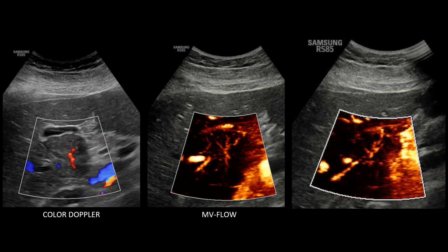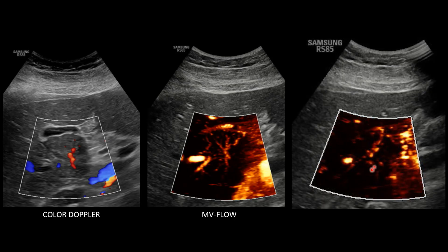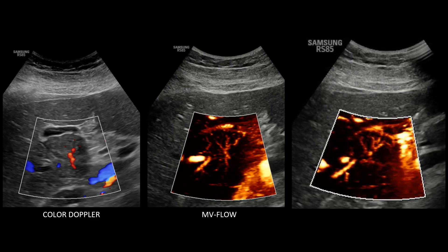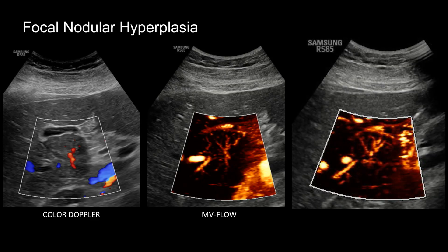When we look at that on real-time imaging, we can see the vascularity pulsing within the central aspect of the lesion with the stellate configuration, and this is typical for focal nodular hyperplasia.